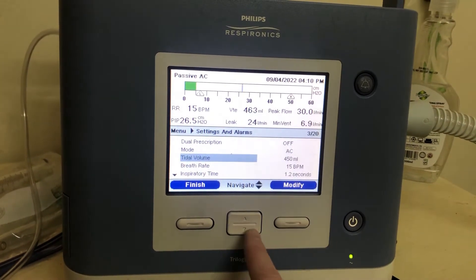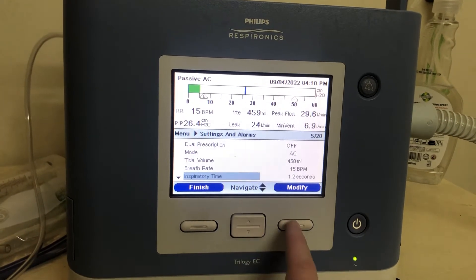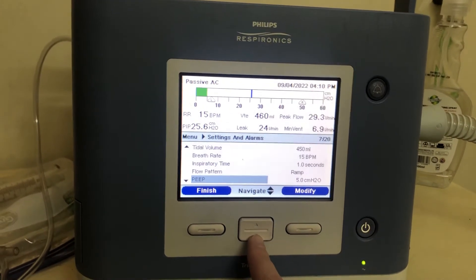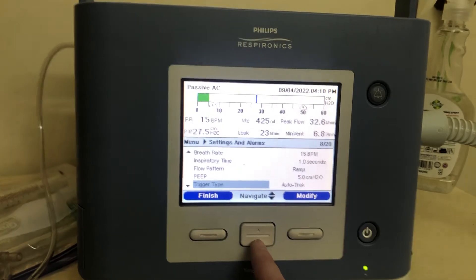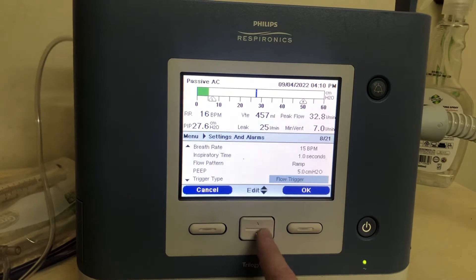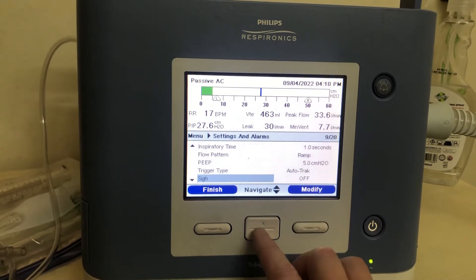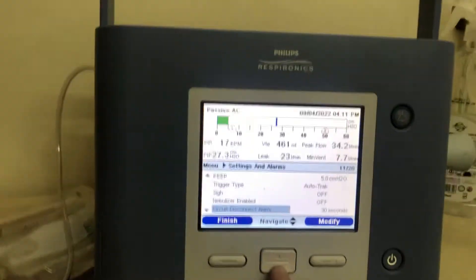Hit OK. You can change your tidal volume, rate, inspiratory time — normal is about one second. PEEP, we set at five. For trigger type, auto track is what I recommend. If you use auto track sensitive or flow trigger, it might auto-trigger a little bit, so auto track seems to work the best. Sigh we like to leave off. Nebulizer we don't need.